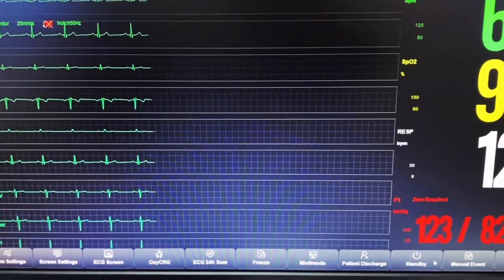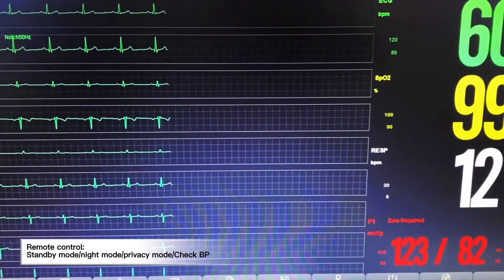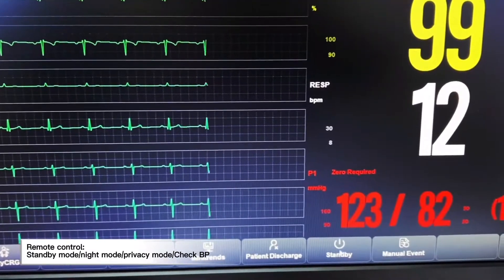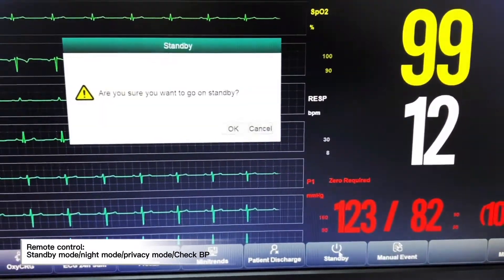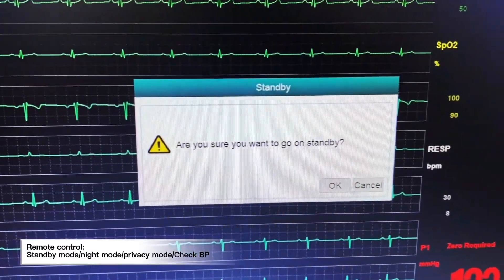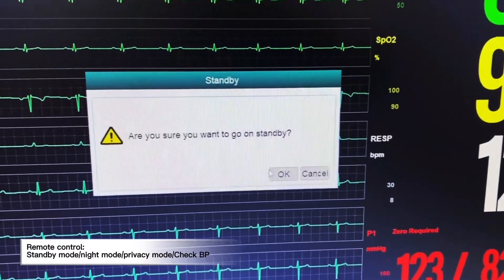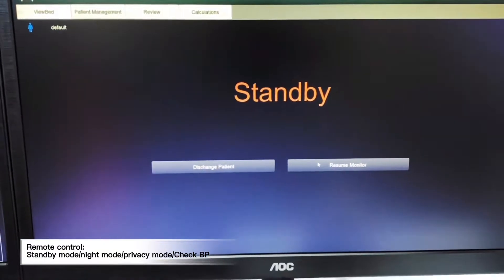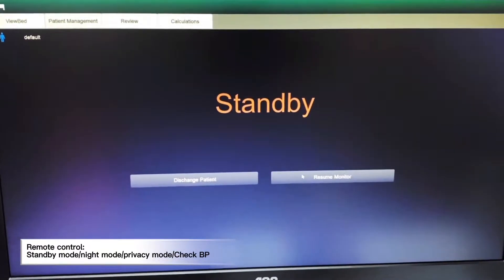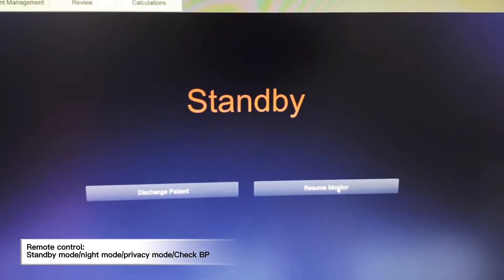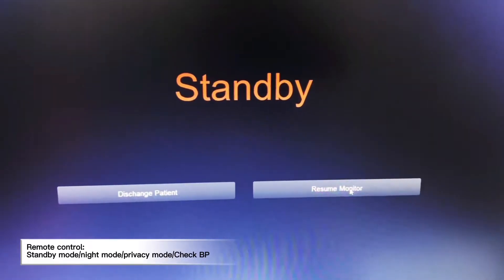From the CMS, we will be able to remotely put the patient monitor into standby mode. Once we click standby, the system will prompt a notification asking: are you sure you want to go to standby mode? We click OK, and the respective monitor will go into standby mode. We can also resume monitoring.